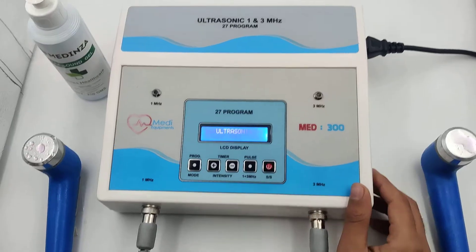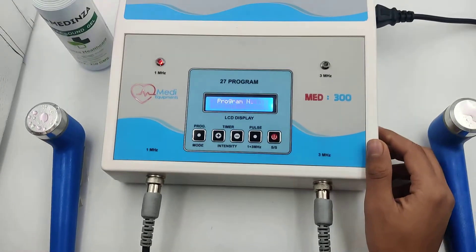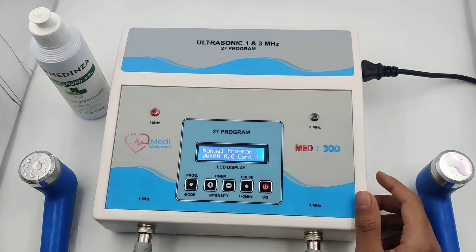Switch on the machine and attach the probe wire. The machine will start with a manual mode, and you can set the details as per your need.